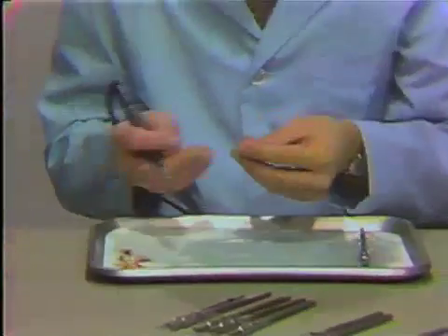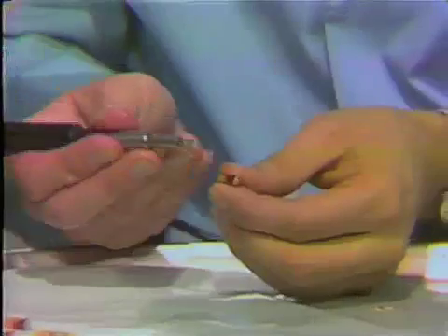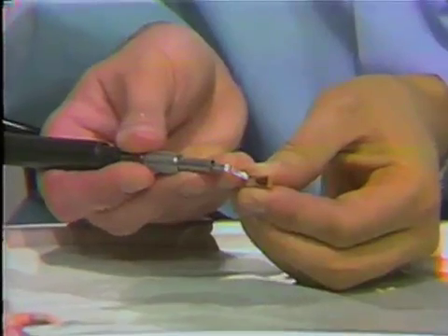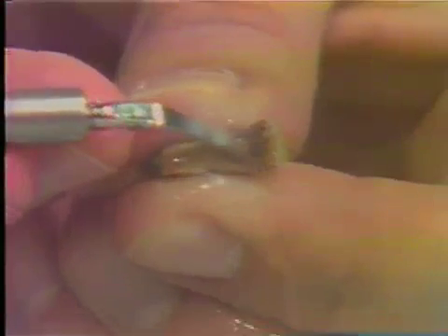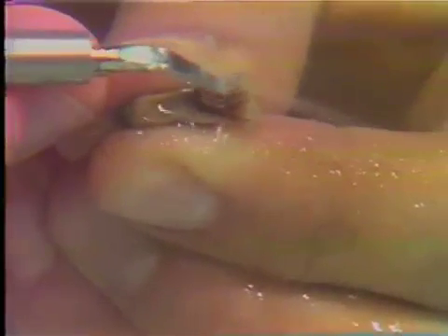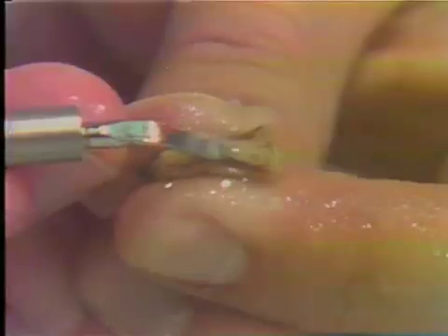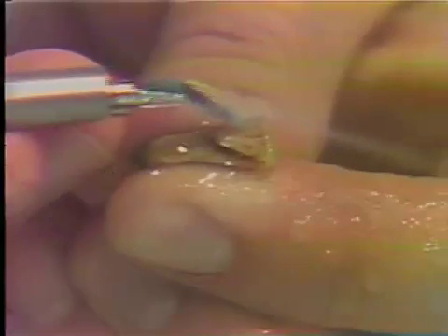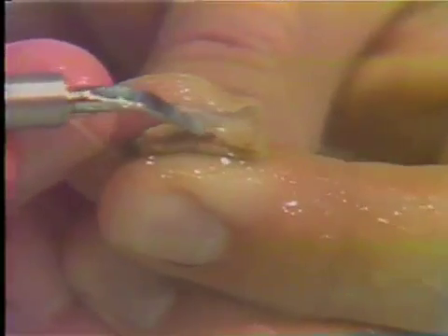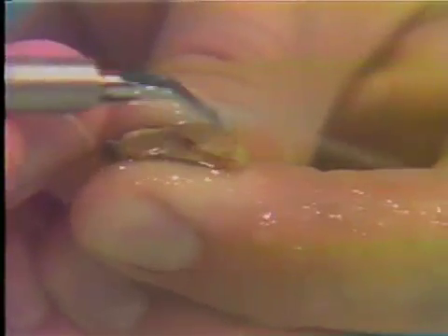Let me take one of these teeth with a fair amount of heavy stain on it. I'm going to come from an angle you couldn't use in the mouth, but for demonstration purposes this will show you a little more easily. It's just a matter of using the tip of that instrument with a wiping motion back and forth until all of the stain is removed. It's possible polishing may have removed this stain, but most people have found the Cavitron to be a very useful instrument for stain removal on the enamel surface.